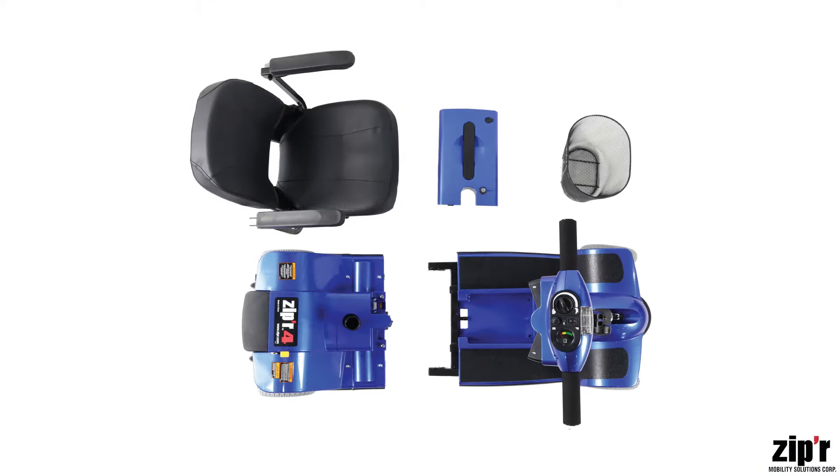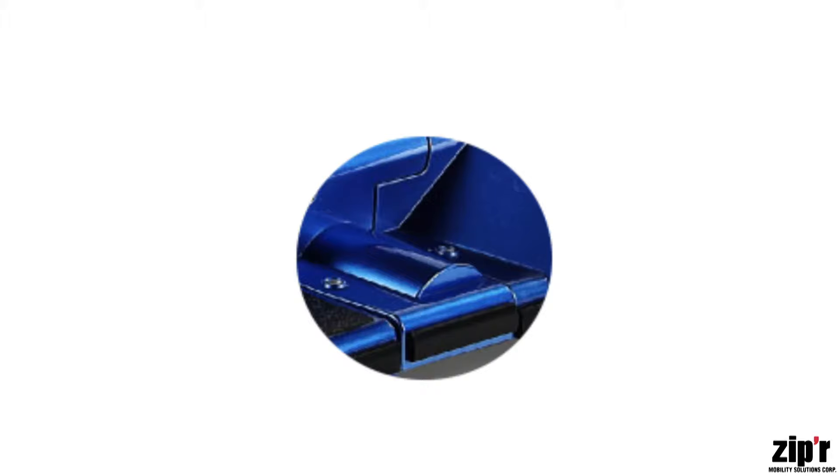Today's video will go over the assembly of your Zip'r Xtra Mobility Scooter. The Zip'r Xtra Mobility scooter line features a removable panel providing the rider an additional four inches of legroom over standard traveler models.